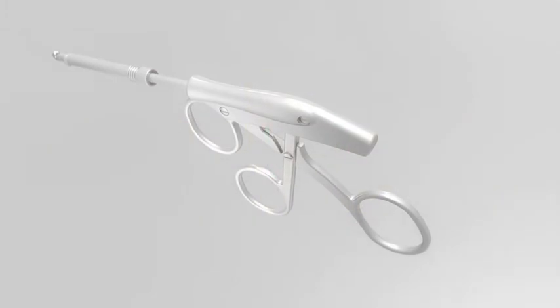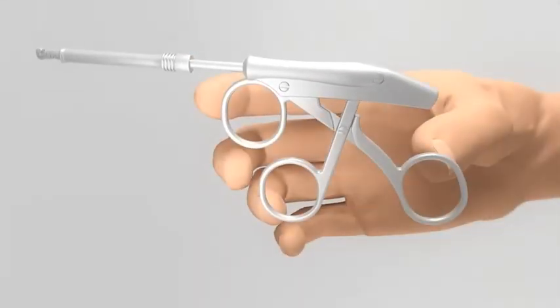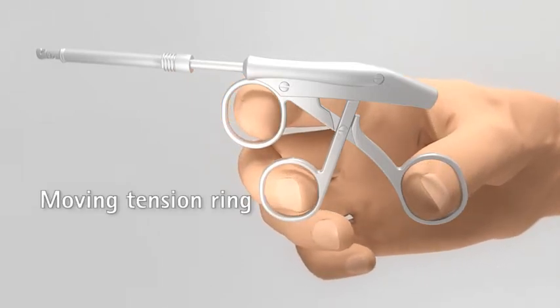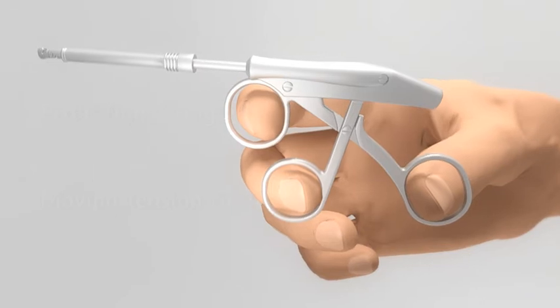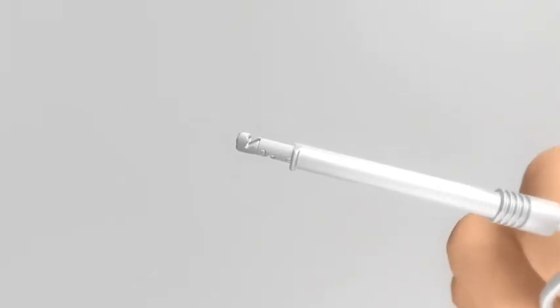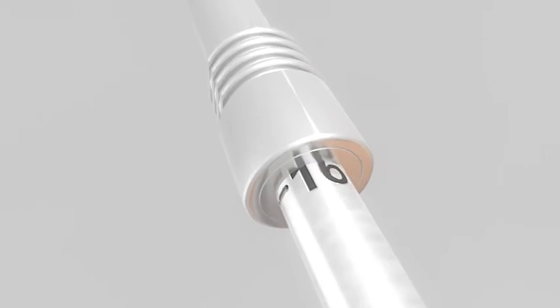The insertion tool may be used with either the right or left hand. To hold the tool, use your thumb and place fingers in the moving tension ring and the fixed finger ring. During the sizing process, you will use the depth collar to move the connected sliding depth ring forward and backward. This corresponds with the numbers on the depth scale for setting correct insertion depth.